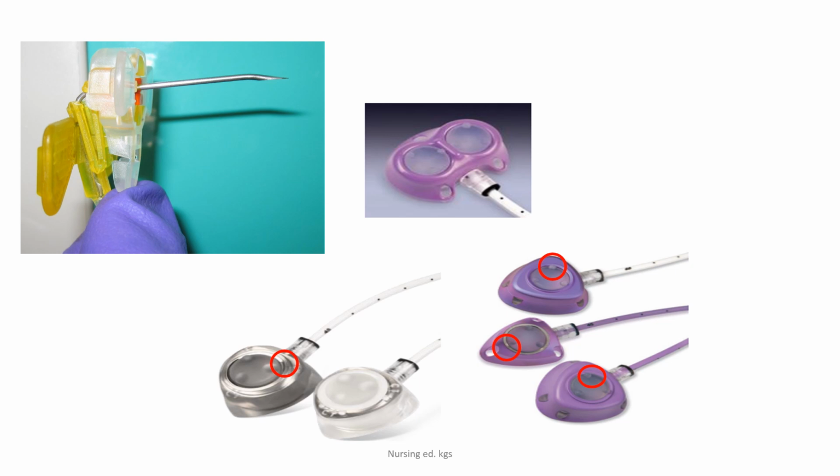They can be used to administer TPN or total parenteral nutrition, and they can also be used for blood sampling. There are some ports as well that can be used for high-speed injection during CT scans or MRI tests, and these ports will be called your power injectable ports.